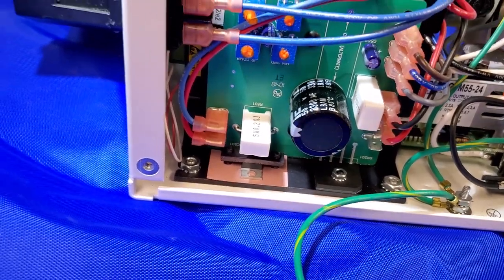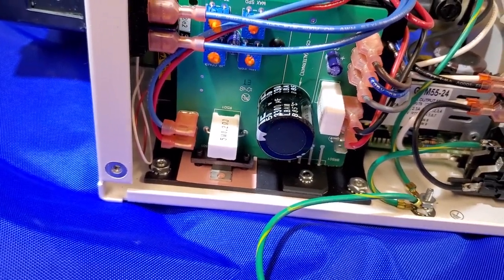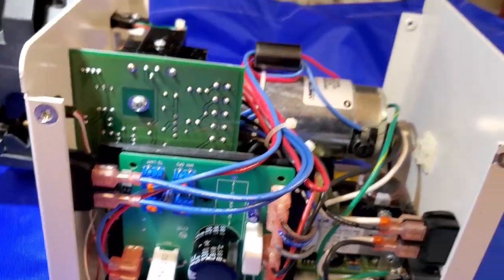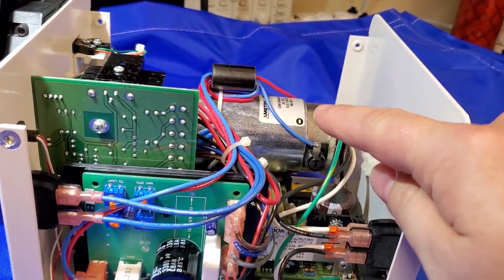It's on the thermal pad. That must be your transistor, which creates your pulse width modulation of your 24 volts DC.